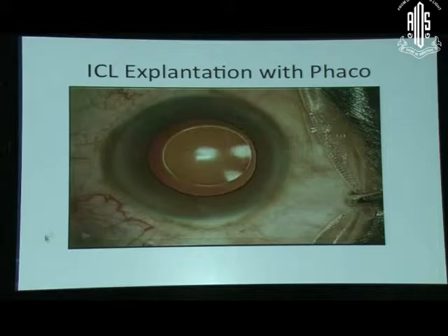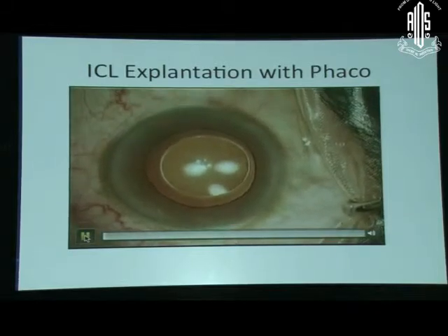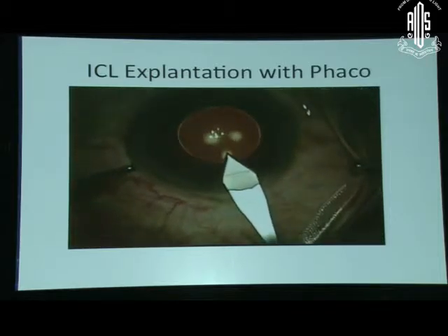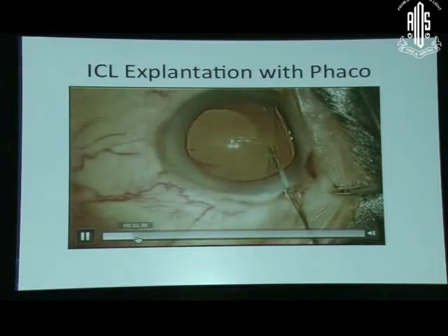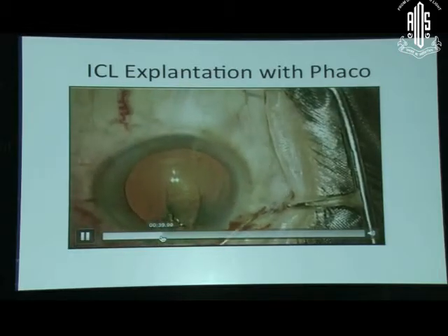The surgery you saw is very, very simple in these cases also. The IOL power calculation is simple as in routine cases. So these patients would be high myopic patients. You have to modify your formula to SRK2. And the removal, as you saw earlier, you can just remove the haptic here. Then subsequently, you can pull the entire lens out with forceps.